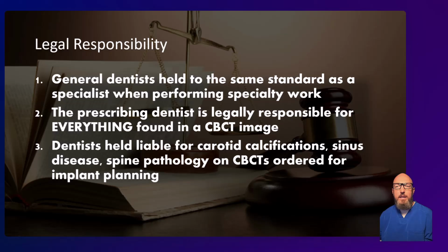Well, a CBCT volume contains a lot of incidental findings: sinus pathology, TMJ abnormalities, calcified carotid arteries, cervical spine anomalies, pathology in the ramus or condyle, in the brain, airway abnormalities. Any of those can be present and clinically significant, and you are legally responsible to identify them or have someone else identify them. There have been cases where dentists were held liable for missing carotid calcifications, sinus malignancies, cervical spine pathology, all visible on the CBCT that was ordered just for implant planning.